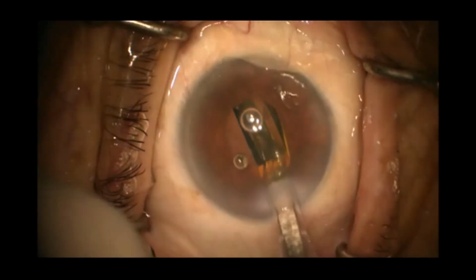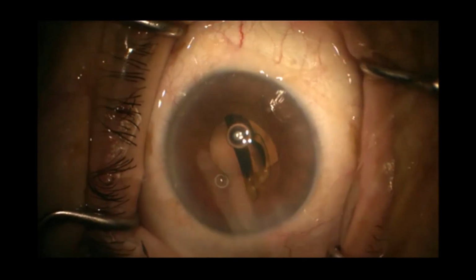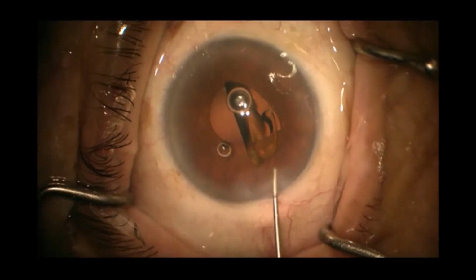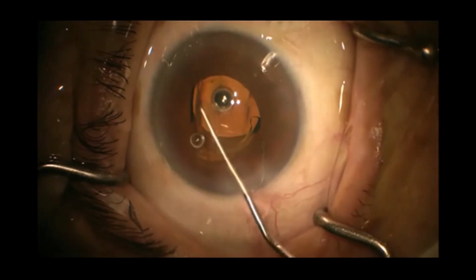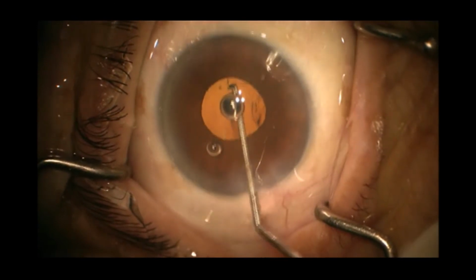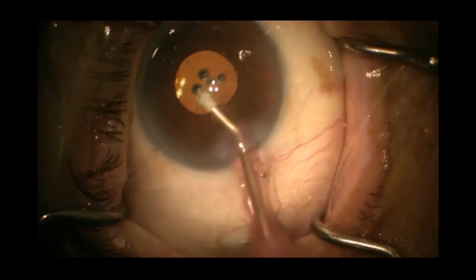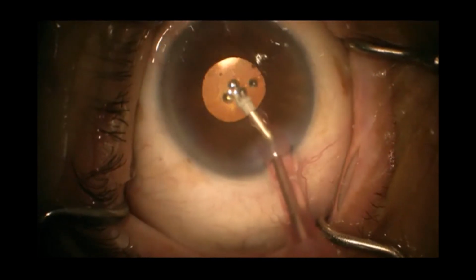A single piece hydrophobic aspheric IOL is implanted with a D cartridge using the 2.4 mm incision. The lens is centered into the bag. Residual viscoelastic aspirated with coaxial irrigation aspiration cannula.